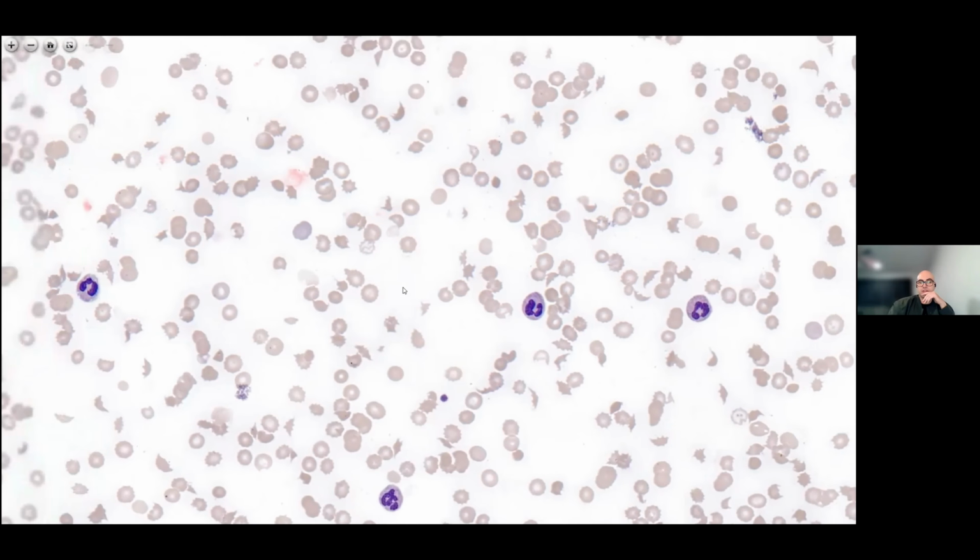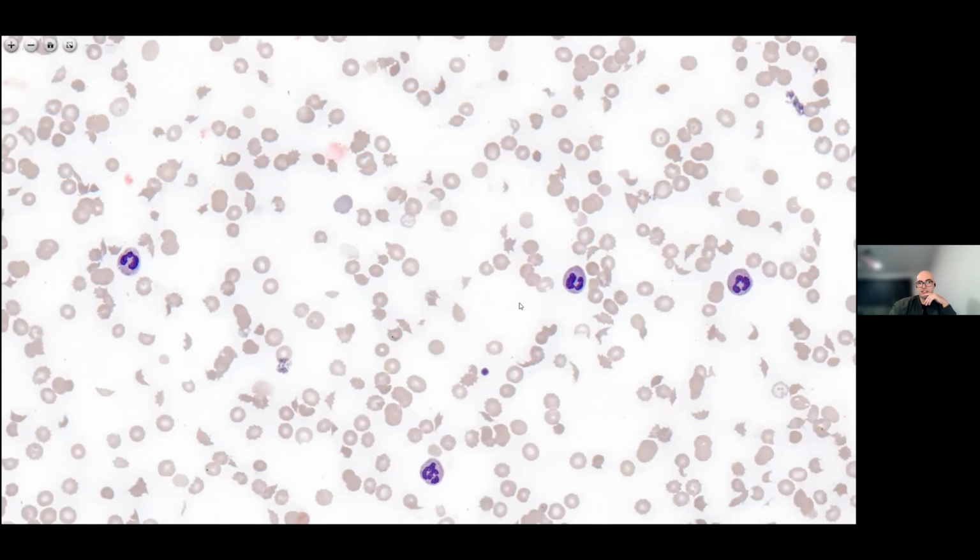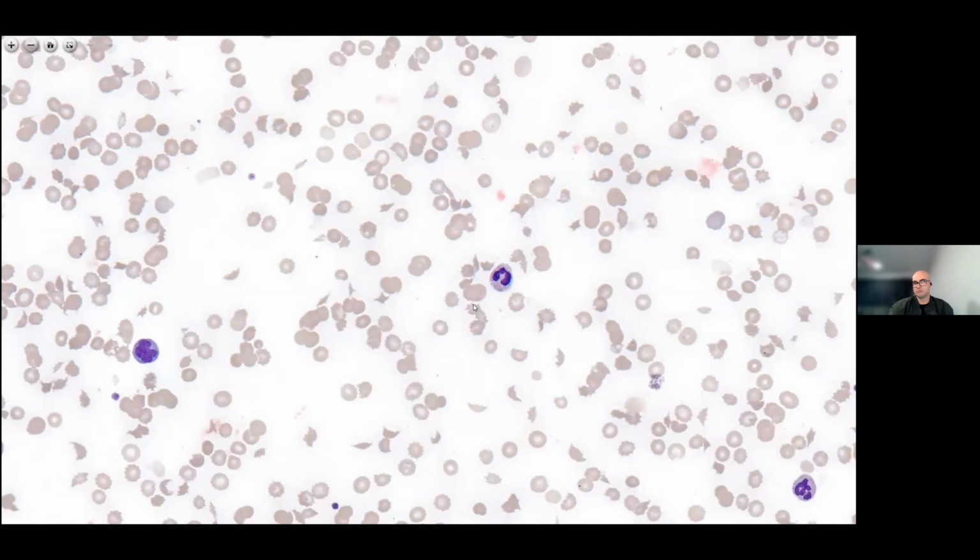So we're not seeing that, but if you go too far in the area of thickness, you might start seeing agglutination, which is different to rouleau. It's red cells sticking together like rouleau, but it's more haphazard, like a bundle of grapes or frog spawn or fish eggs.